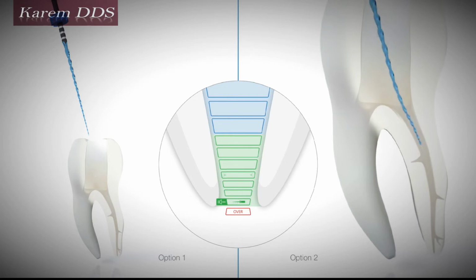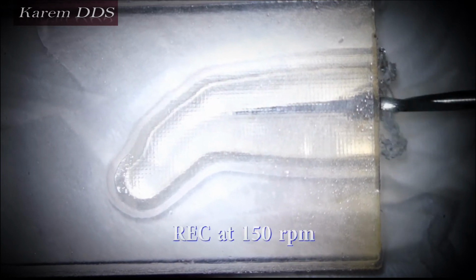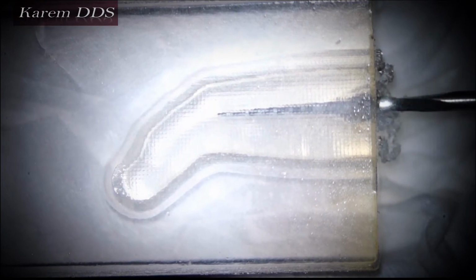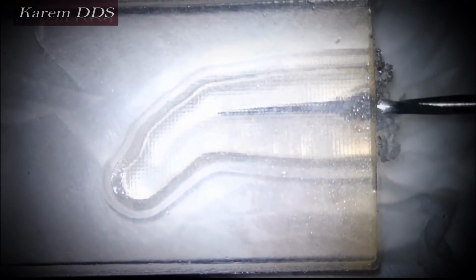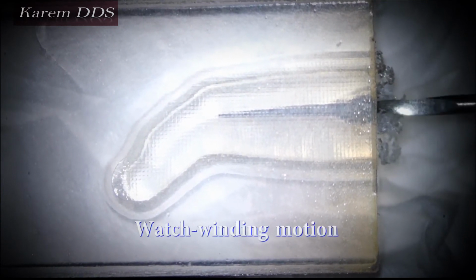Sodium hypochlorite can help lubricate the file and reduce the friction of the movement of the hand files in the canals. Once hand files have been progressed through the coronal and middle regions of the root canals, the canal may be enlarged using hand files prior to instrumentation with rotary nickel-titanium root canal shaping instruments.